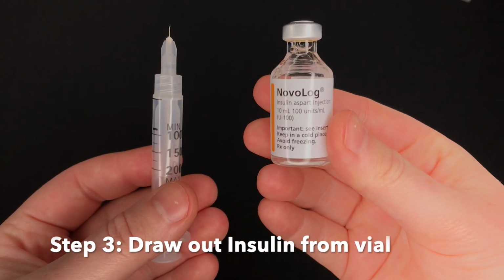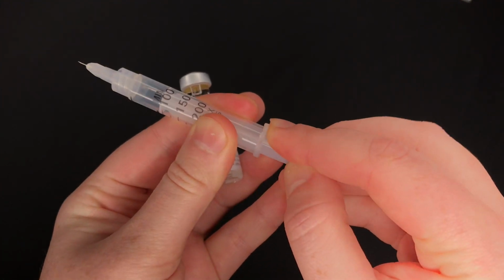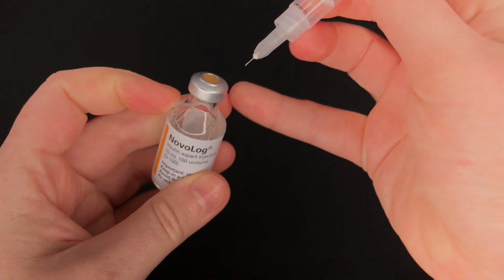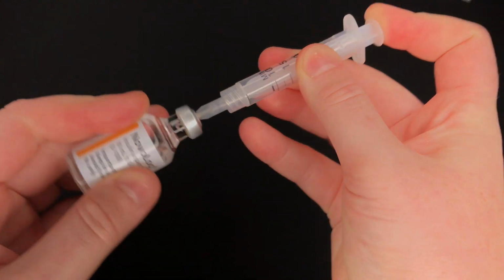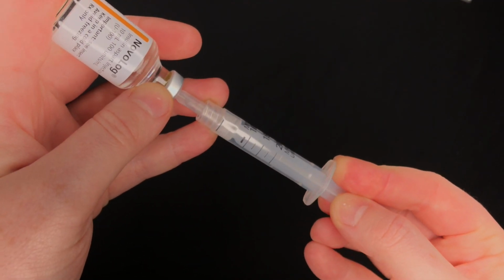Now take your assembled syringe and your vial of insulin, and we are now going to draw out some insulin. Once your pod is activated, it will last for 3 days until it prompts you to change it to a new one. So draw out however much insulin you think will last you for 3 days.